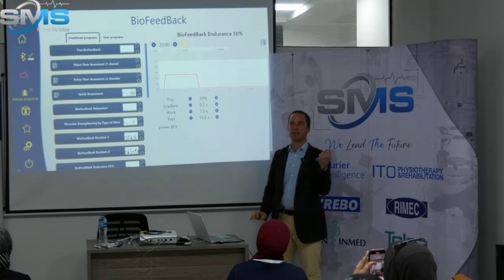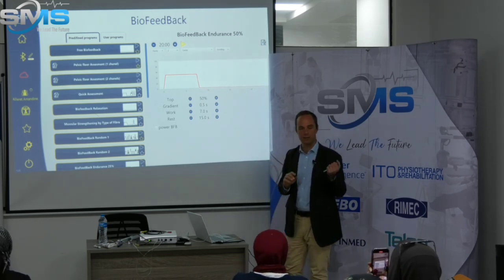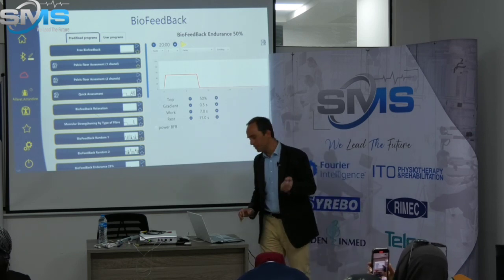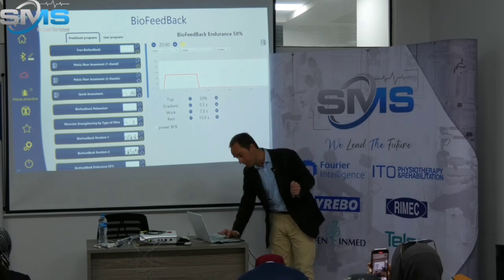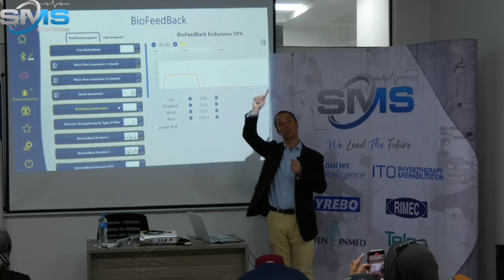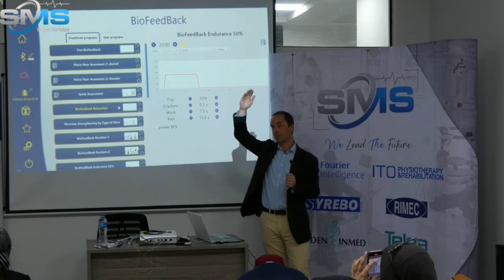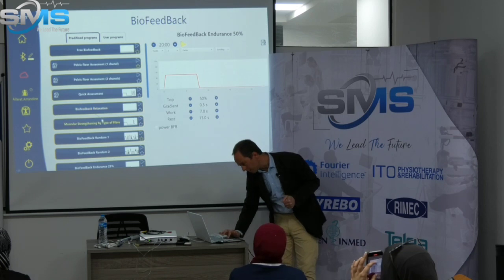I told you that rest time is important. Sometimes you have overactive patients, so you have to work with them. Here, of course, you don't need an exercise telling her to contract more, because what you need is to contract less. So here, we have a specific exercise.